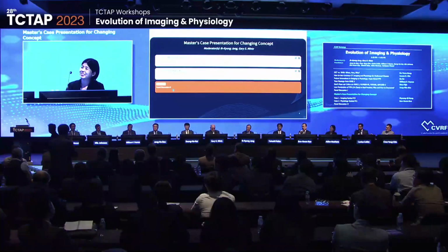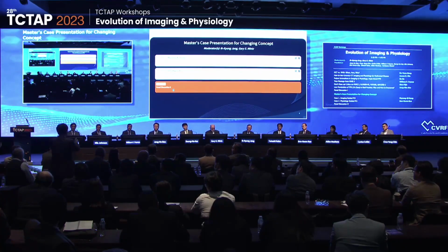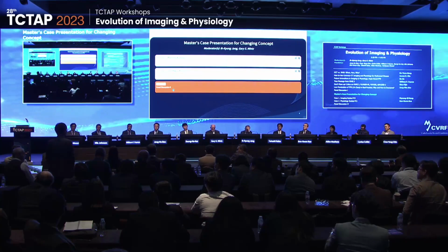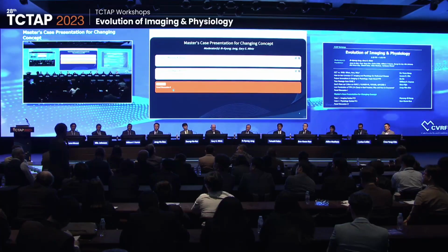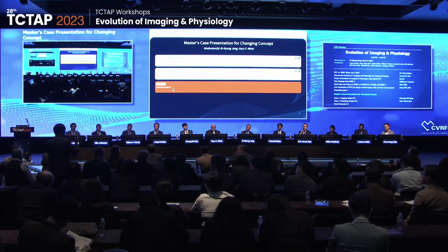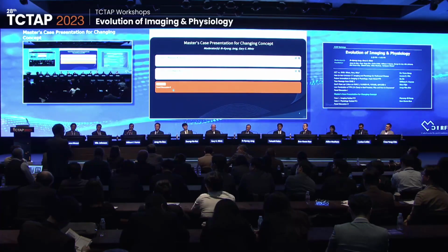Yeah, I have one lesson from the physiologic study: before its publication, maybe we did more PCI in some cases. But with the physiologic study, we have to let it alone. When I look at an intermediate lesion and we do not physiologize, we just let it alone, follow up, and wait for some disease progression or something to happen. At that time, we decide what to do. Maybe everybody has a similar feeling about it.